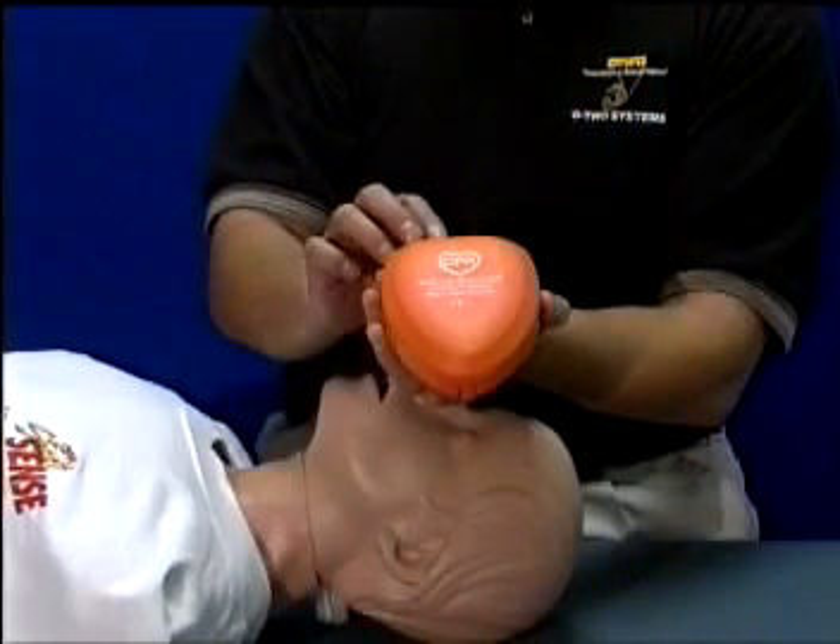Designed to facilitate rescue breathing during CPR while affording protection against cross-infection, the Rescue Breather is an invaluable aid for all levels of CPR-trained rescuers.